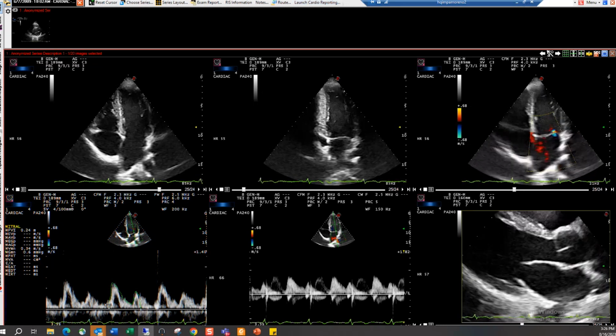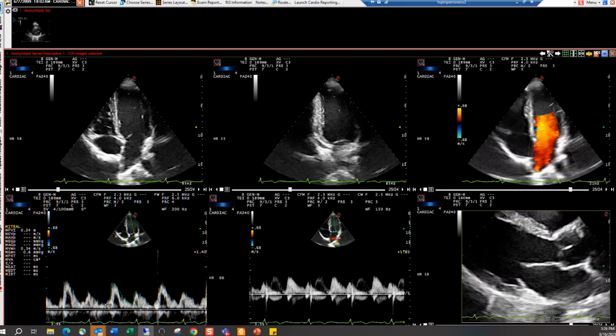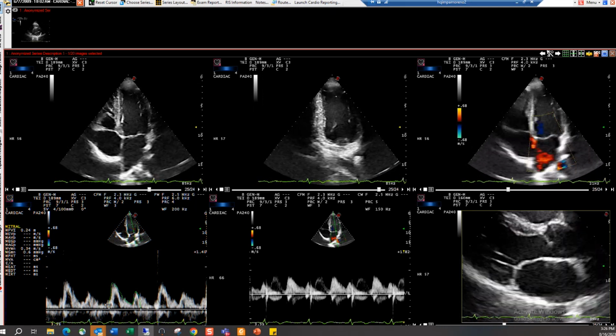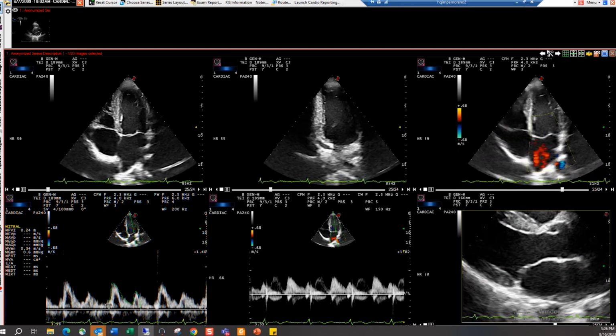So, Rhonda, do you want to just spend a couple minutes talking about the general workflow in the various labs, how it works for the sonographer and the physician? I'll be right back. Sure, that'd be great.